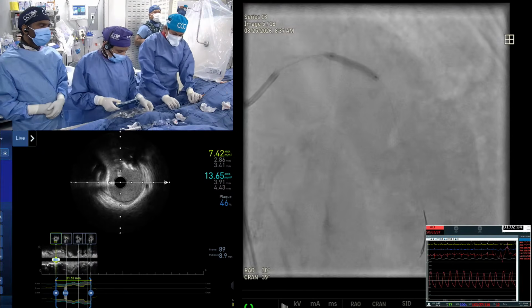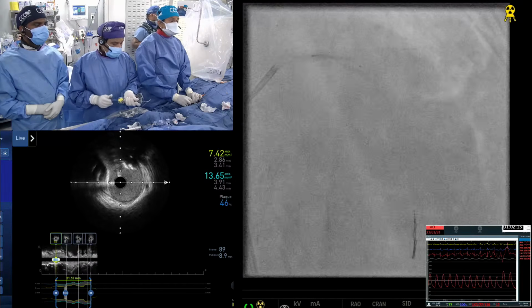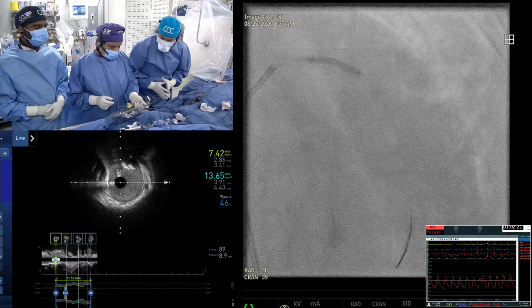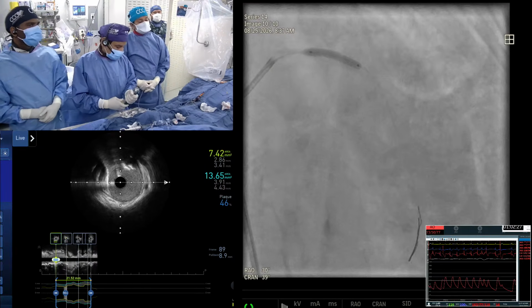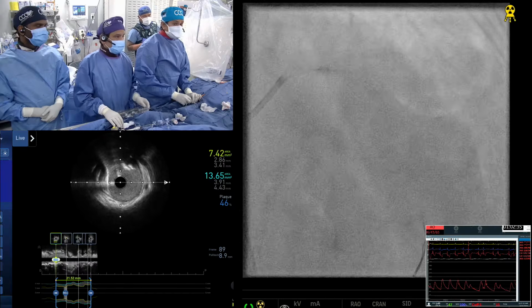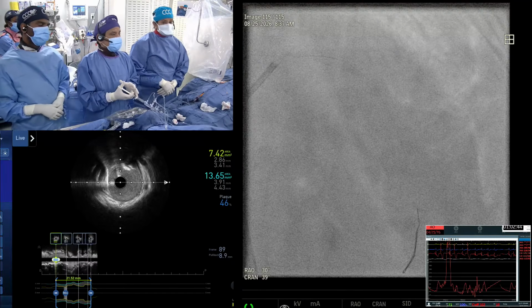I know we have covered it in a previous transmission, but specifically for nodules, what do you think? Is rotational atherectomy better than IVL? A combination of the two? What is your overall strategy? Wait till you get the results of the Nodule Shock trial. We have completed the trial of 120 patients and we have sent it to TCT as a late-breaking trial, specifically addressing this. 100%, yeah. Now, the only question we will not answer with the Nodule Shock trial is whether orbital is better, because orbital has not been used in the trial.